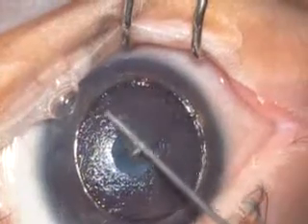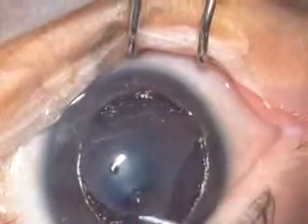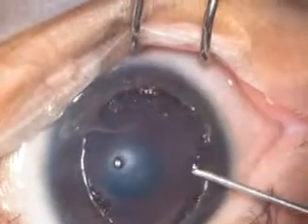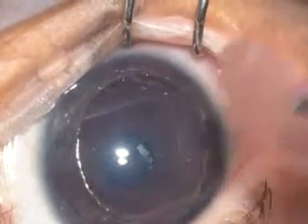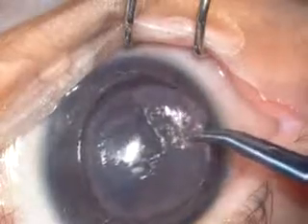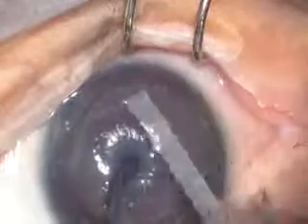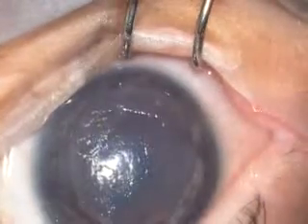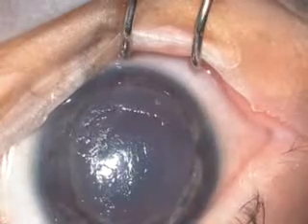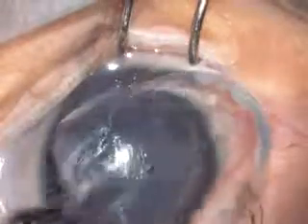Human fibrin adhesive glue, a two-component mixture made of a fibrinogen aprotinin concentrate and a thrombin calcium chloride preparation, is reconstituted and applied as a uniform thin layer. The donor lamella is then placed over the host. The excess glue is ironed off, at the same time adjusting the orientation of the graft to ensure adequate edge-to-edge apposition. A bandage contact lens is placed at the end of the procedure.